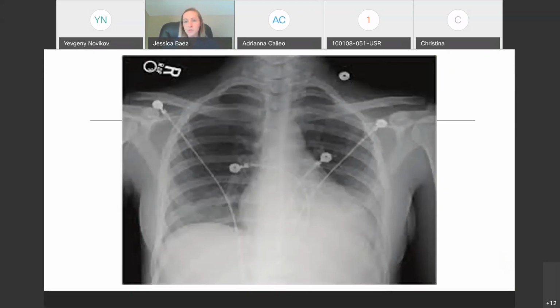All right. So why should you guys care about lung ultrasound? You can get stat chest x-rays fairly rapidly. It gives you some information. However, stat chest x-rays are not immediate, particularly for you guys. I mean, I've rotated in the ICUs and a little bit on the floors, and if you have an acutely dyspneic patient, it sometimes takes a while, a lot longer than you want to. So the beauty of lung ultrasound is that it's something that you can do really quickly at the bedside and actually incorporate those findings into your patient care really rapidly. And so it's really helpful for the patient who is acutely short of breath.